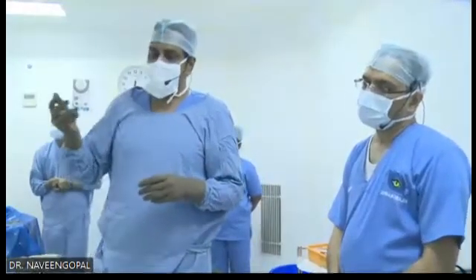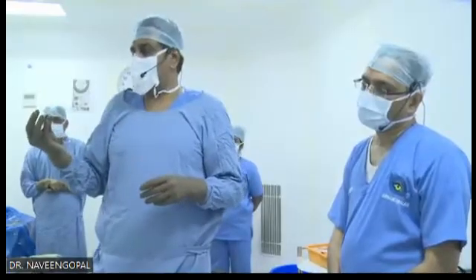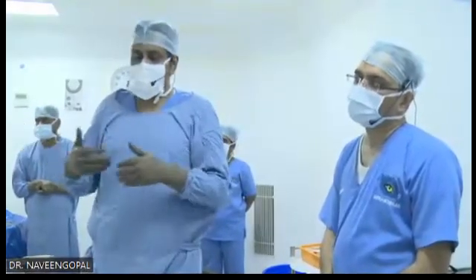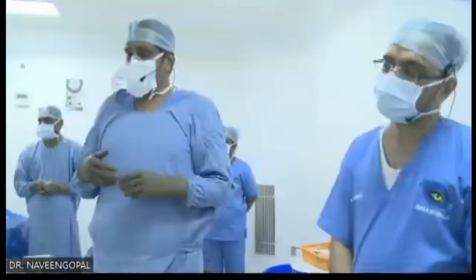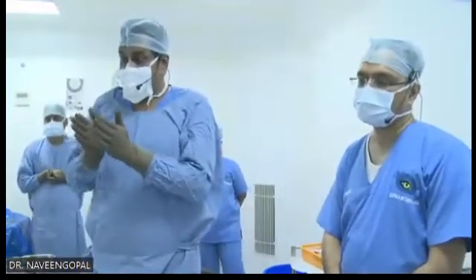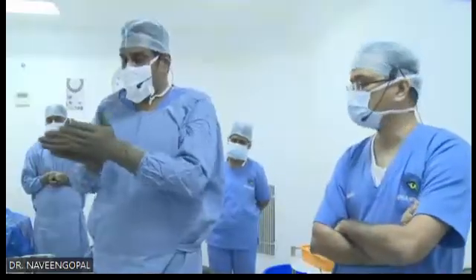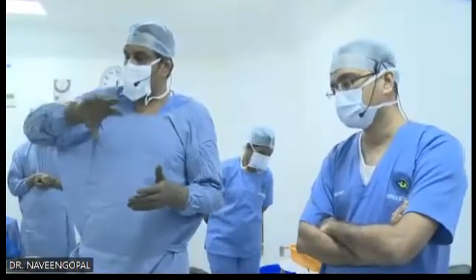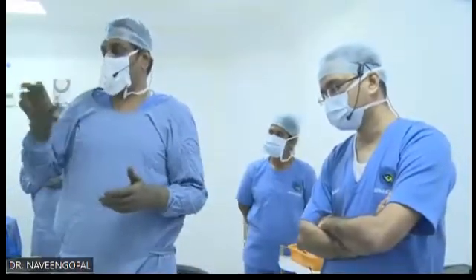Usually it doesn't rotate as easily as an IOL because it's a big lens and the space for it to rotate is too little. That's why you can't rotate more than 15 degrees once you put the ICL. Without damaging the ciliary body, it is very difficult to rotate once you put it in.